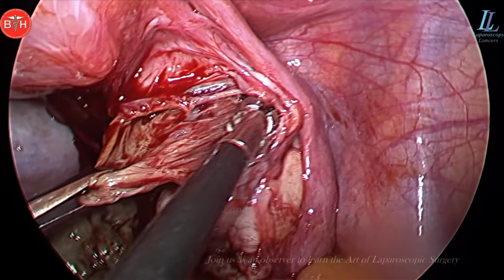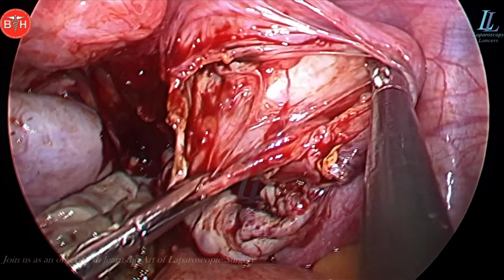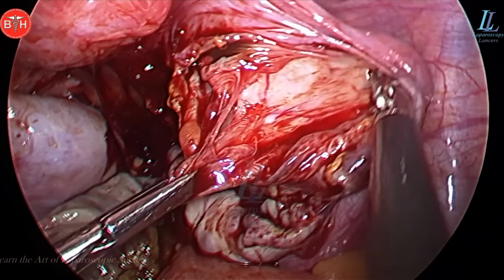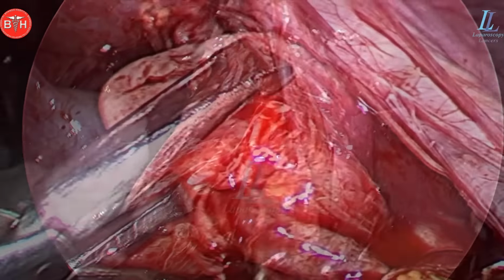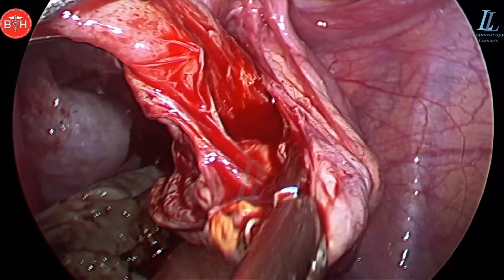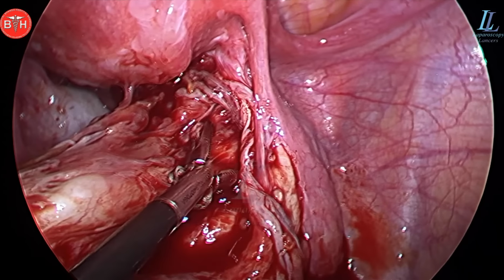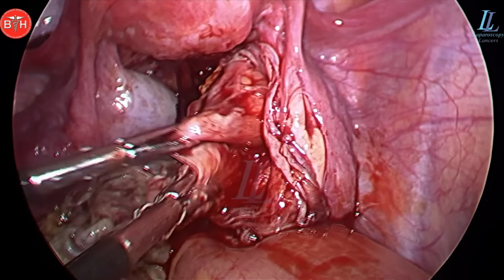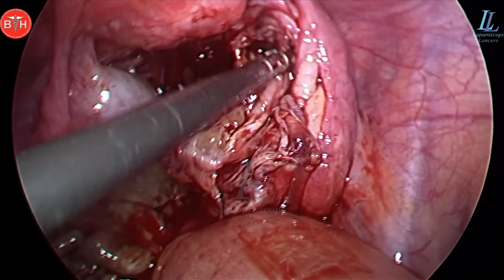So there dissection continues. I am not using any current or thermal things, as the ovary has to be saved 100%. No thermal injury should be required. Will not be using any bipolar or monopolar. No electricity, no current to be used. Just push and pull, and if you are in the right plane, nothing else is required. This ooze will stop automatically. No drains, no tranexamic acid, nothing should be required. There you can see the whole game is traction and counter traction.